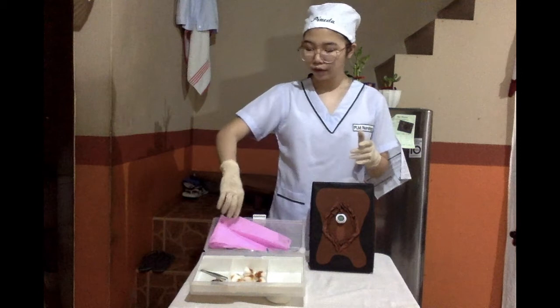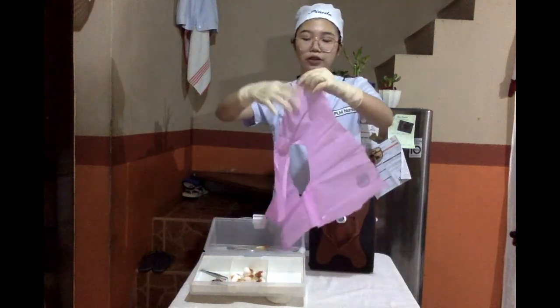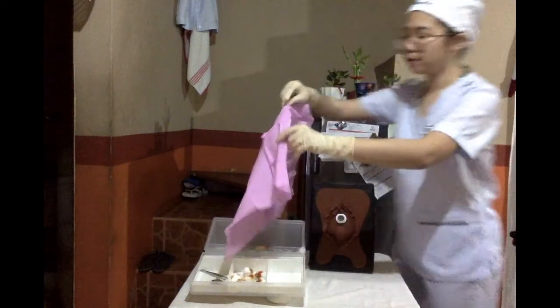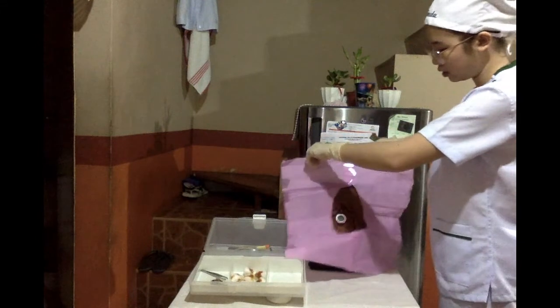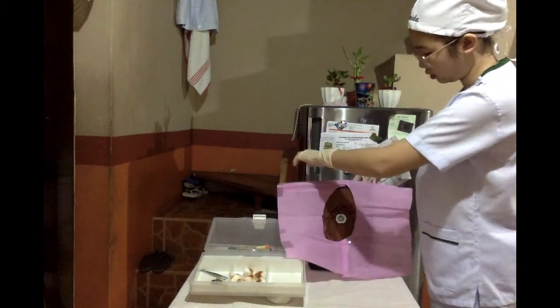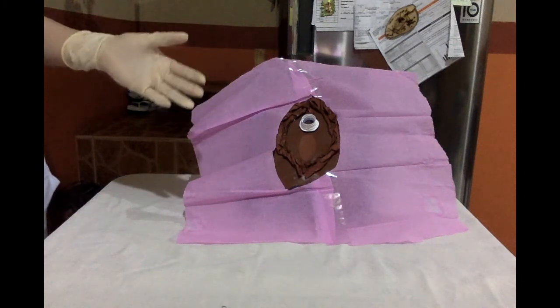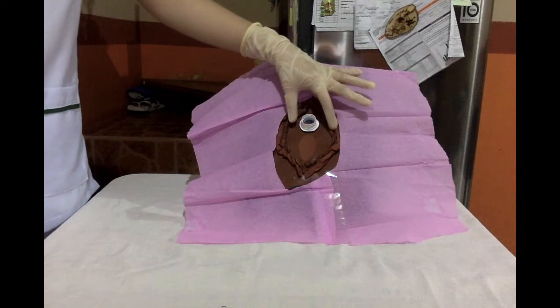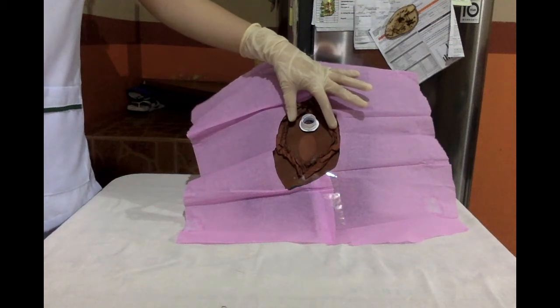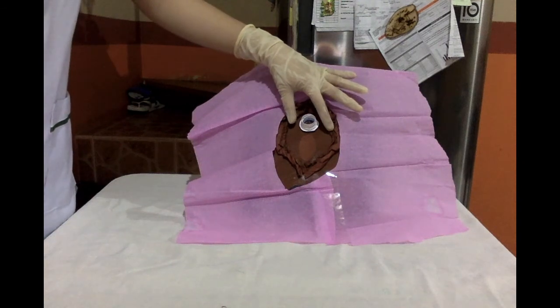I will remove the fenestrated drape from the catheterization kit and put it over the perineum to expose the labia. So this expands the sterile field. Using my non-dominant hand, I will be separating the labia minora to expose the urethral opening. And using my dominant hand, I will be holding the forceps and pinch the cotton balls with the iodine solution to cleanse the genital area.